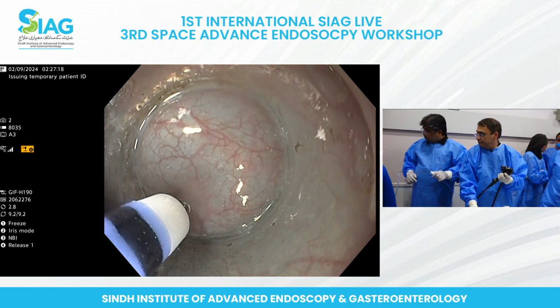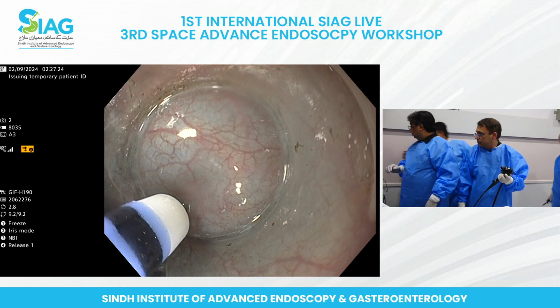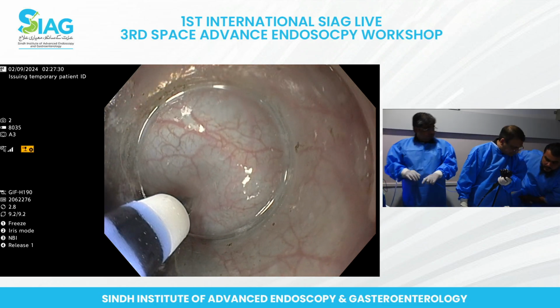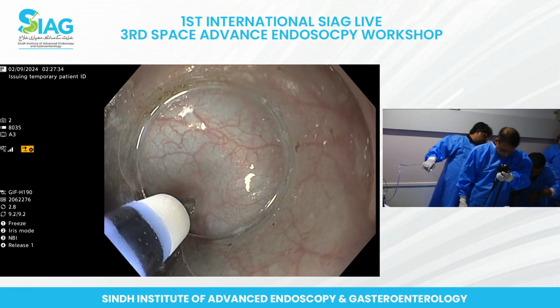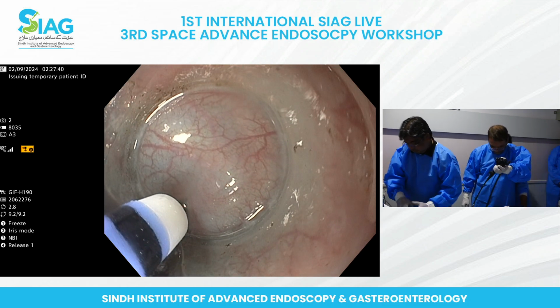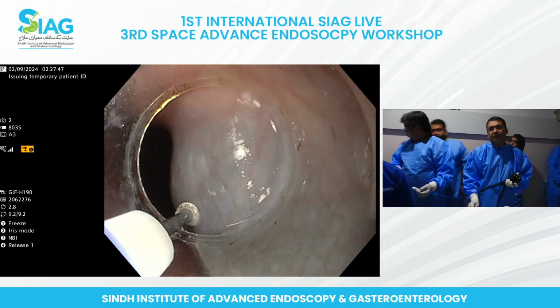It's not working. Is it done? Sir, people were coming and going near the lead here. So the lead is not connected. The neutral lead. Yeah, so that's why it didn't work. Let me know when ready.